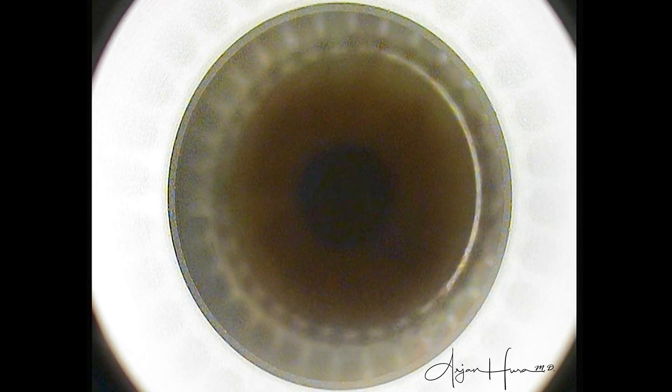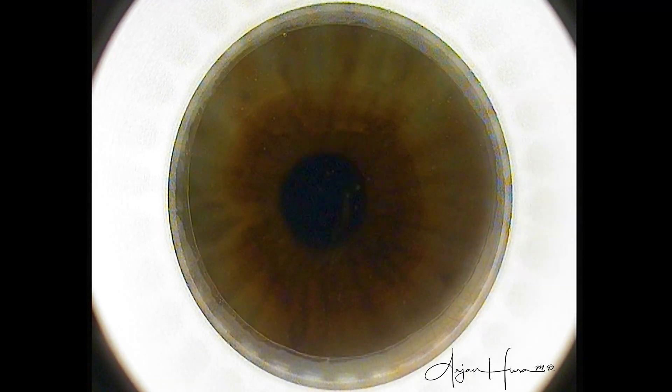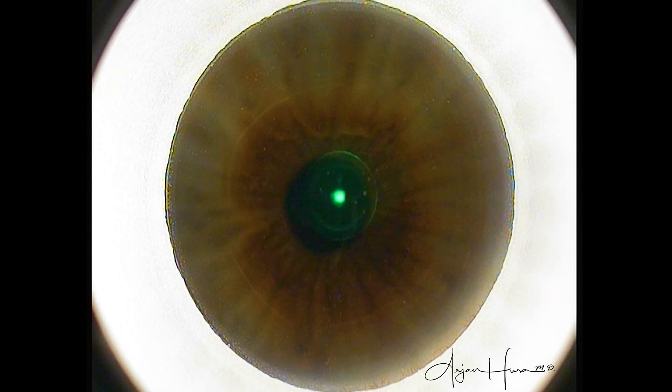Same thing here — we are centering the cone on the visual axis. Can you guess which eye this is? This is the patient's left eye, and the visual axis is slightly infranasal here as well. Let's watch and see how that lenticule is created again.